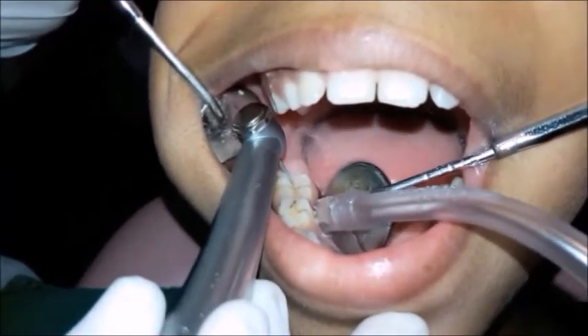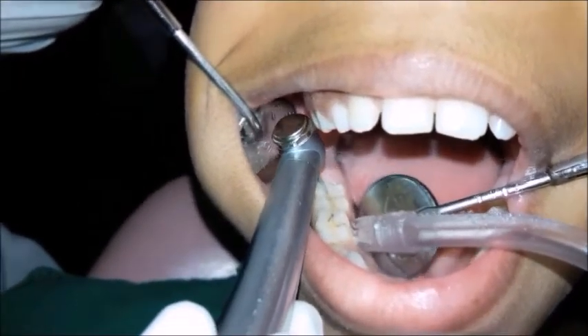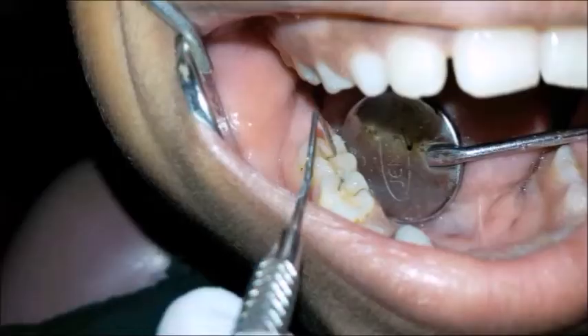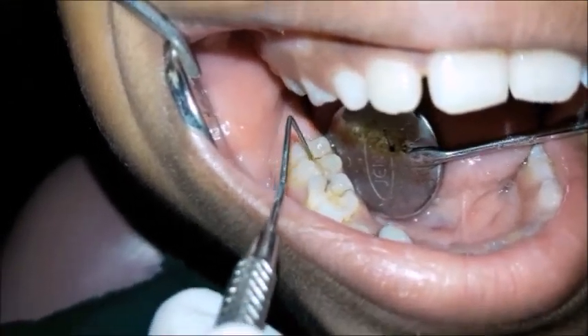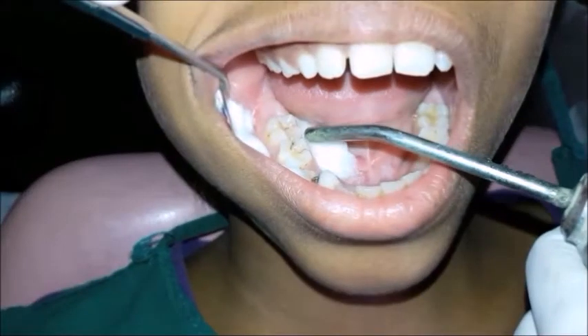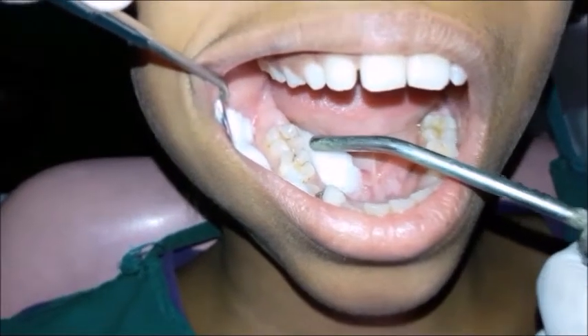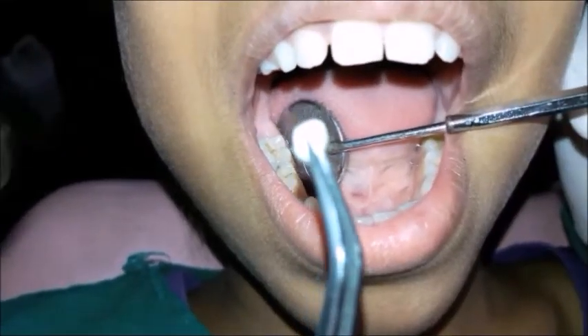Isolation is done with the help of suction, and the mouth mirror is used for the retraction of the cheek for proper vision. Following fissurotomy, inspection is done using a probe for any remaining caries. The fissure is then dried using a three-way syringe and the field is maintained dry with cotton rolls.